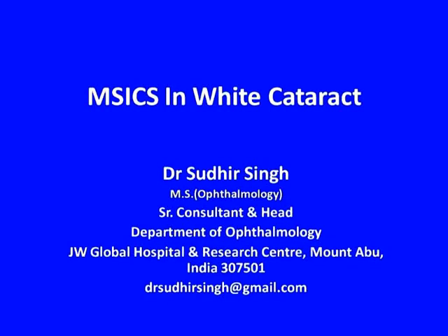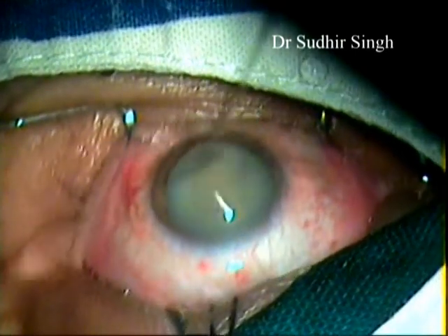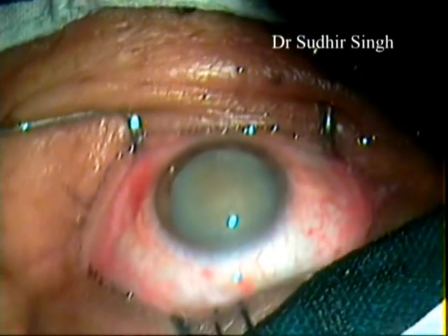Hi, I am Dr. Sudhir Singh. I am going to demonstrate Intratonal Phacofracture Nucleus Management Technique of Manual Small Incision Cataract Surgery in White Cataract.